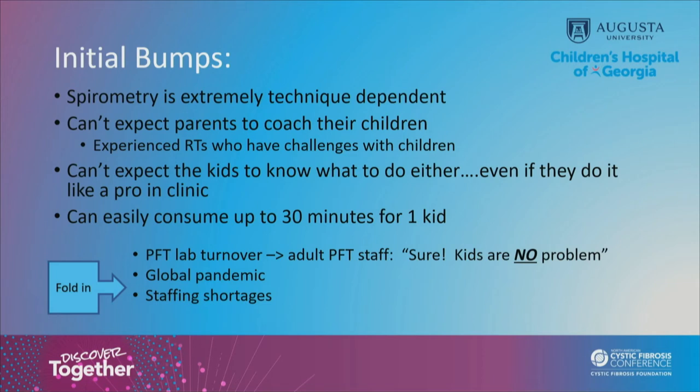But fold in every other center's problems with the global pandemic, staffing shortages, realignment of staff, the halt in aerosol-generating procedures meant our PFT lab staff was kind of left twiddling their thumbs, and so job realignment went to support the ICUs, whether they were comfortable actually working in the ICU or being more supply and just kind of support for the ICU staff. Jobs were realigned. So really getting spirometry efforts for a successful clinic and accurate assessments was very difficult.